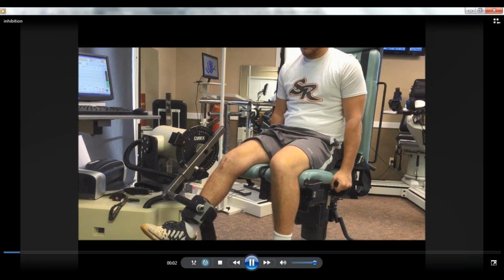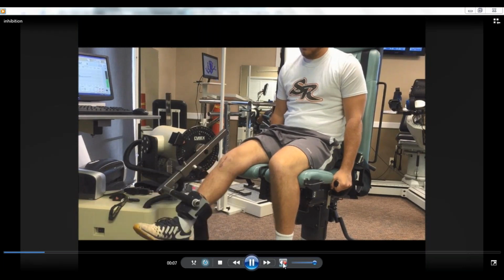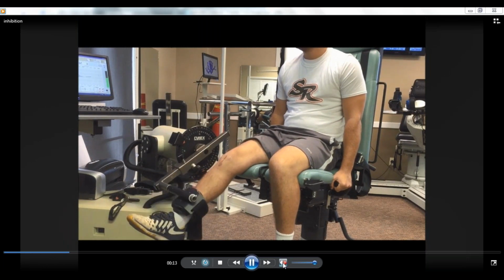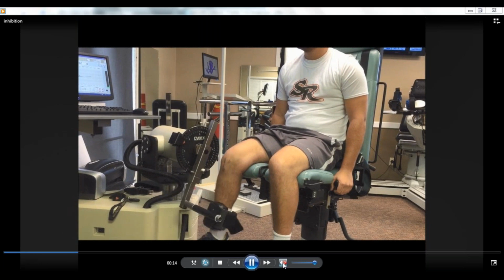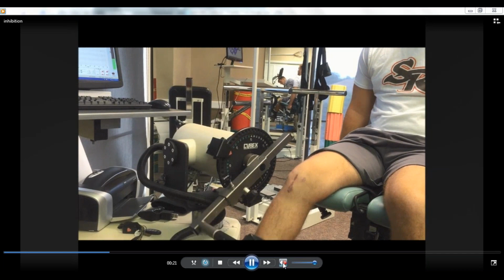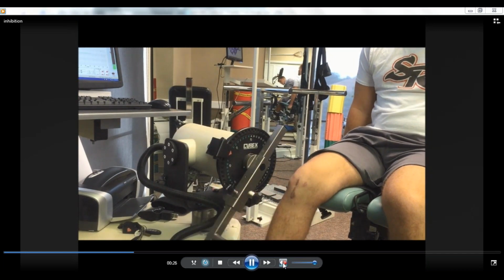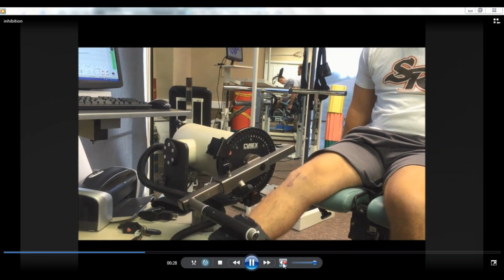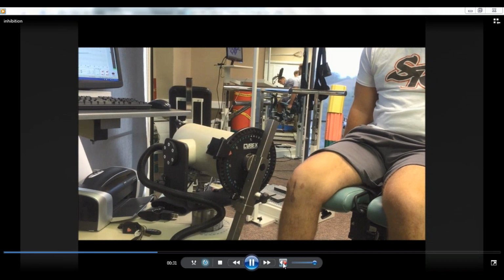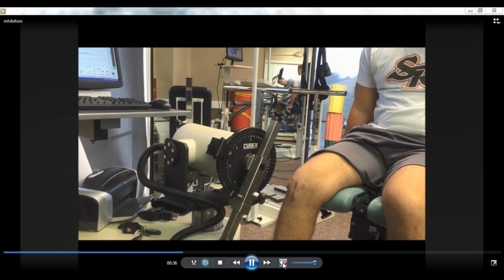Happy to, Daniel. So what's going on is the patient is contracting eccentrically, but I want you to watch his quadricep and knee. As he's contracting, he's getting a shutdown or an inhibition from his knee because he hasn't trained eccentrically. So it's almost like the inhibition signal coming from the knee is shutting down that volitional contraction of the quadricep, but his brain is telling that quadricep to go ahead and contract. So it's almost like you're flicking a light switch on and off back and forth.